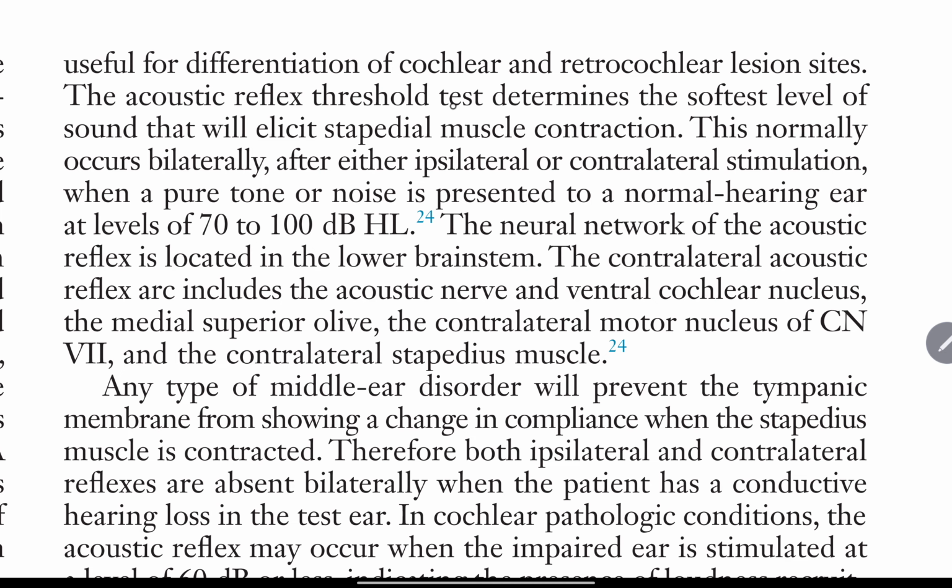The acoustic reflex threshold test determines the softest level of sound that will elicit stapedial muscle contraction. This normally occurs bilaterally after either ipsilateral or contralateral stimulation when a pure tone or noise is presented to a normal hearing ear at levels of 70 to 100 decibels hearing level.